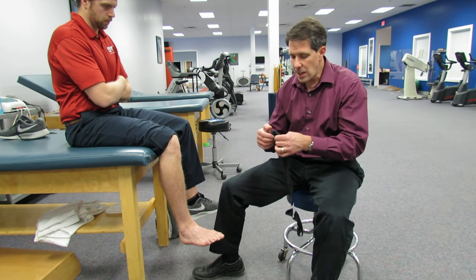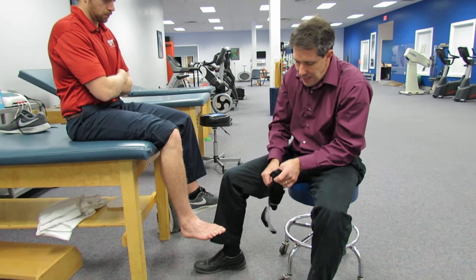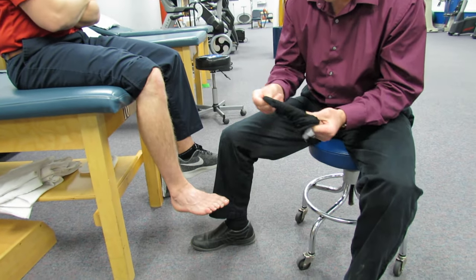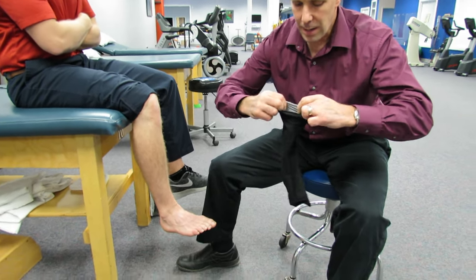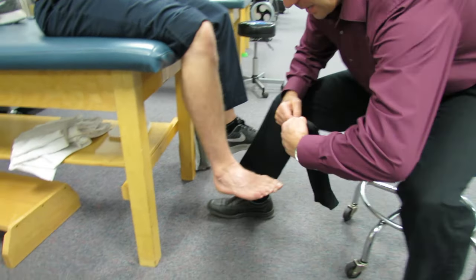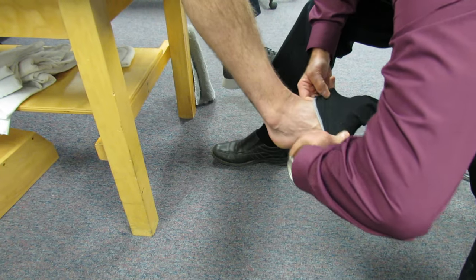So just a couple tricks. What you want to do is take the sock and turn it completely inside out, pulling it all the way through so that this area here is going to go over the top of the foot. When you slide the foot in, it is going to go right to the end, just like this.